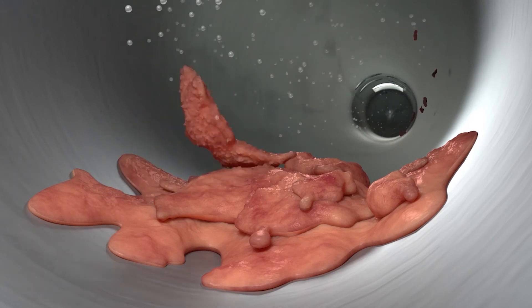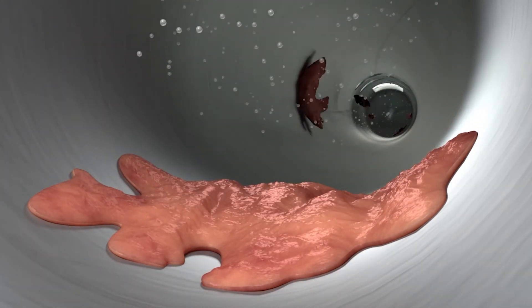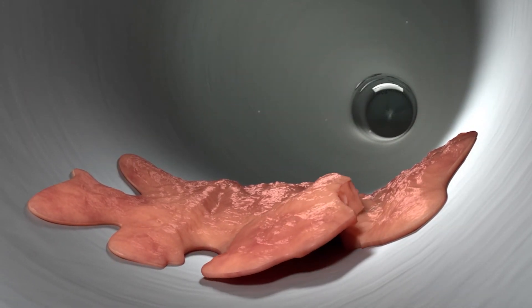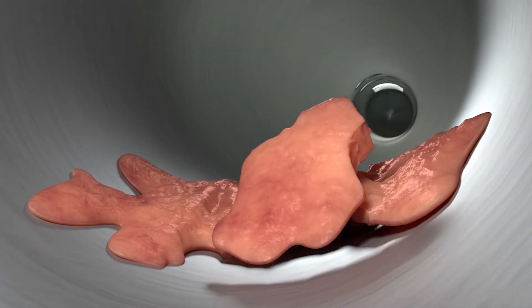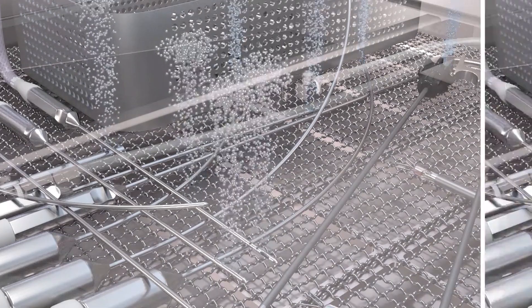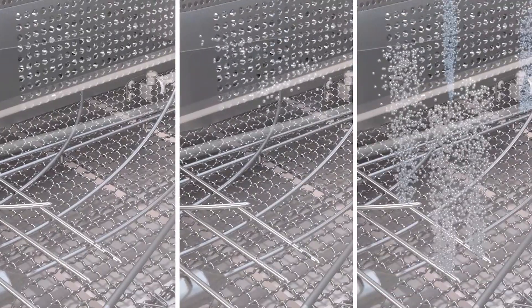After soaking, the ports are flushed with a fresh water and air mixture. The micro-bubbles in the agitated flush implode due to ultrasonic action, which breaks the bio-burden up. Fresh water then flushes the cannulated instrument. The fresh water and air mixture occurs three separate times during the 21-minute process.